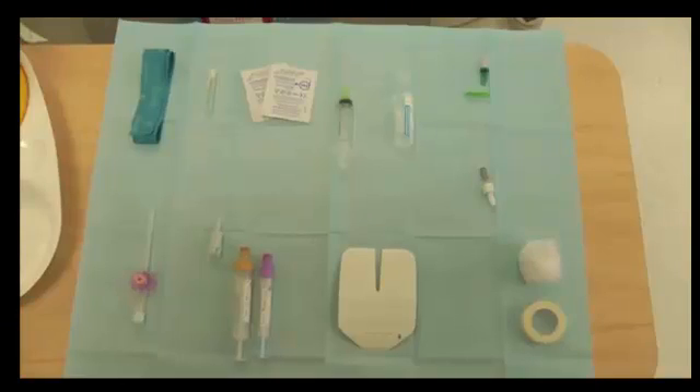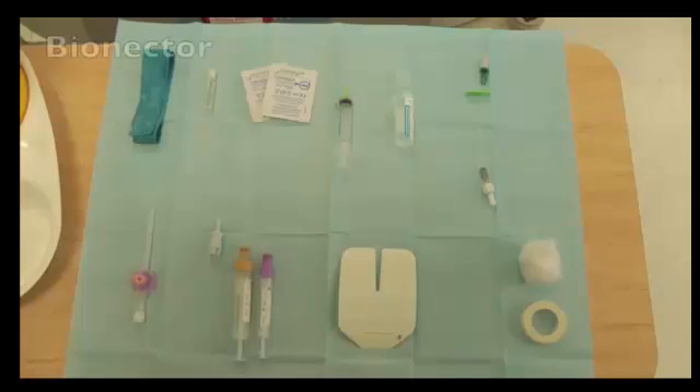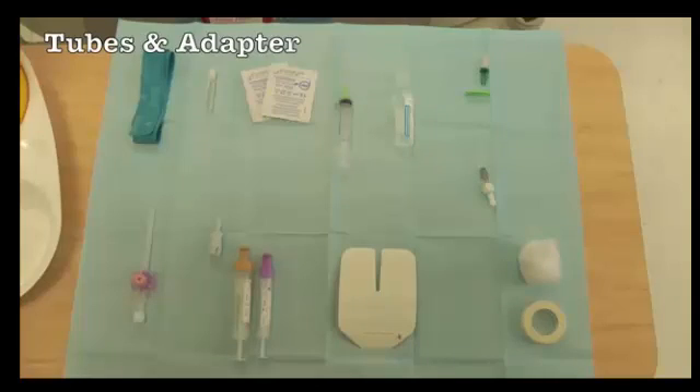The key to success is preparation. You will need a tourniquet, a cleaning stick and wipes, a needle, syringe and bottle of saline for your flush, a bionectar, an appropriately sized cannula, blood bottles and adapter if you plan to also take blood, a dressing and some cotton wool and tape just in case.